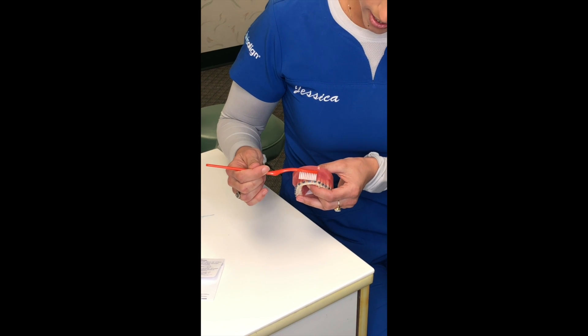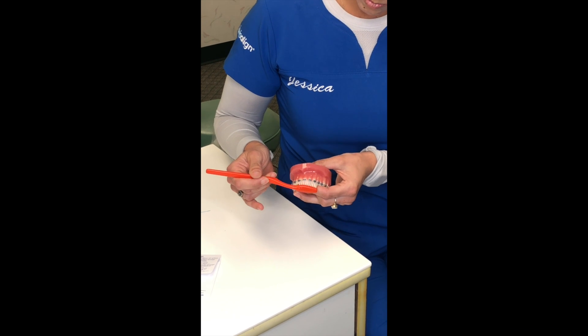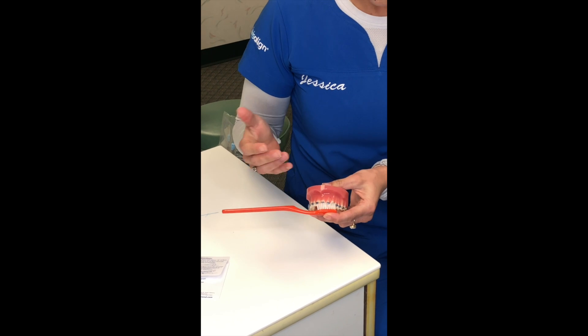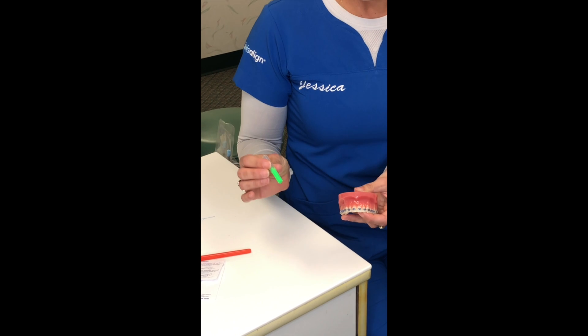Once you're angling it, you want to do circular motions on top going all the way around, and then circular motions underneath. You'll notice that by doing circular motions, the bristles can really get under the brackets or under the wire and between the brackets to keep everything really clean.